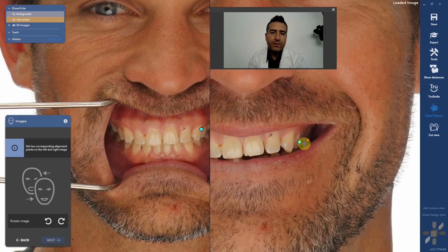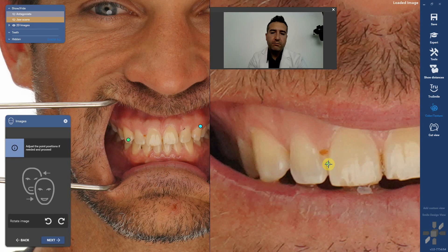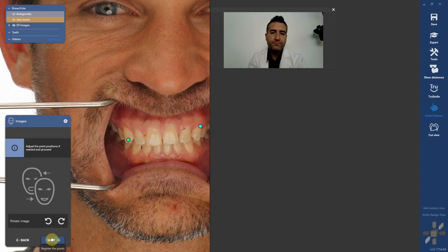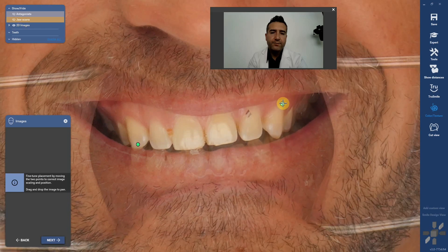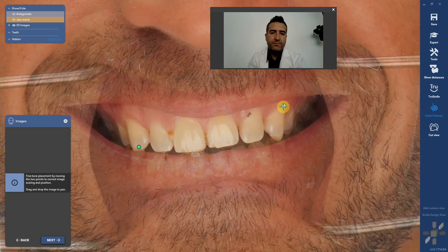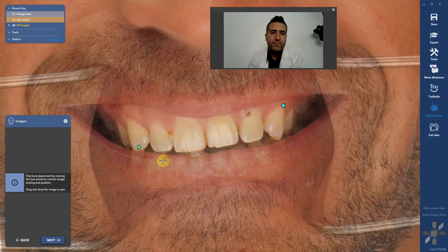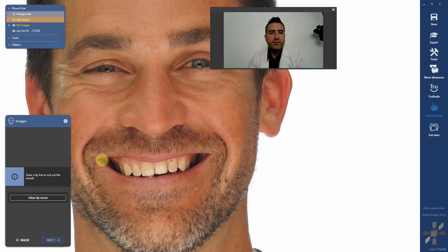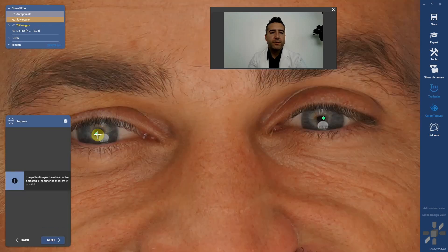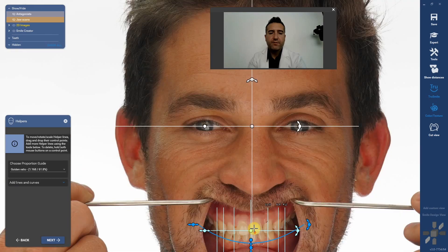I always go to manual alignment, and you're going to drop a ball on some coincident areas — again one high, one low — and then fine tune everything to make sure you're getting these lined up as best as you can. Now it's going to ask you for the lip curve. Do that real quick. Interpupillary line — do that real quick. Midline. You can see it's got kind of a canted maxilla here.